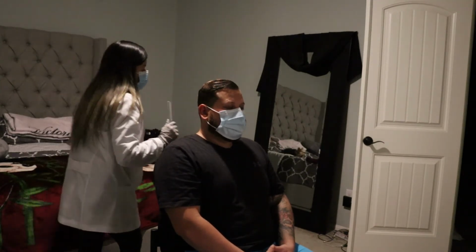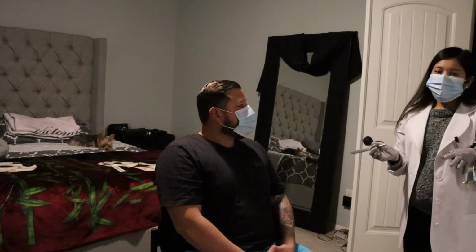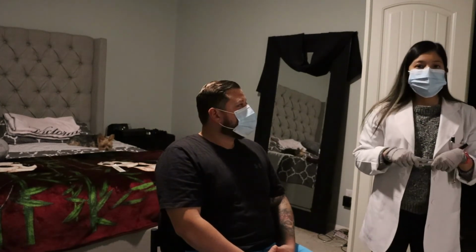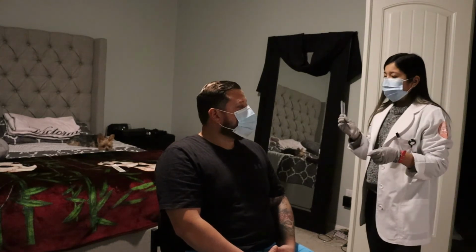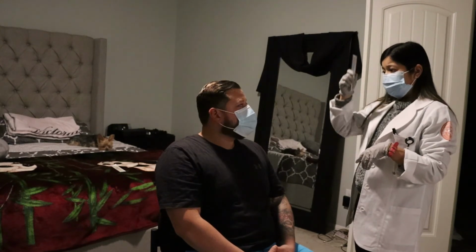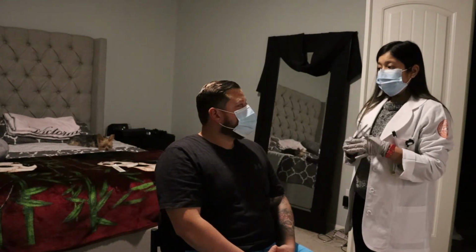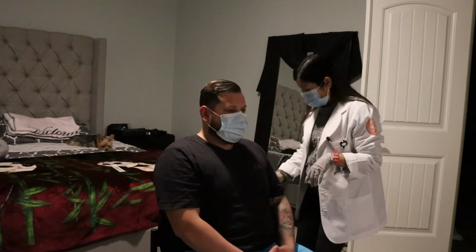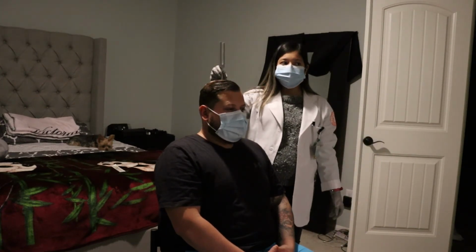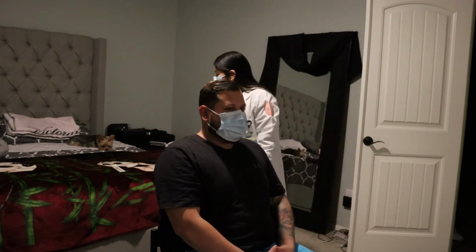Okay. So we just tested air conduction versus bone conduction. Air conduction is normally twice as long as bone conduction and should be about the same for both ears, which it is. So now we're going to test, it's called the Weber test. I'm going to put this on your head, midline, and I want you to tell me if you hear the vibration more on the right, on the left, or if it's equal. Okay? Okay. I would say it's about equal. Okay. Very good. It should be equal.